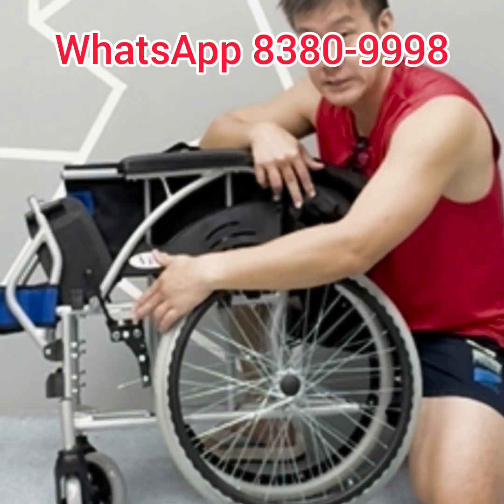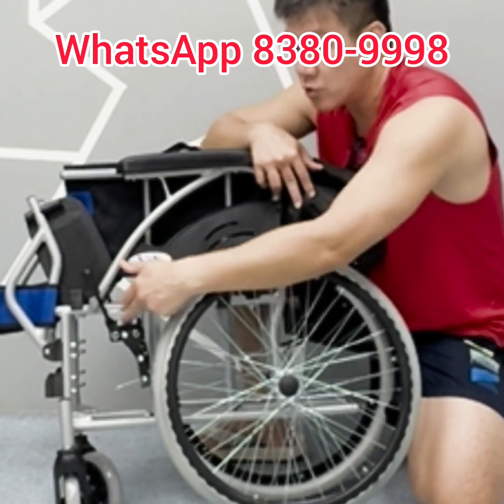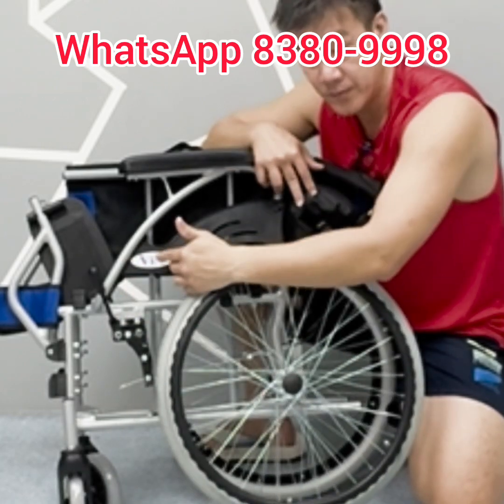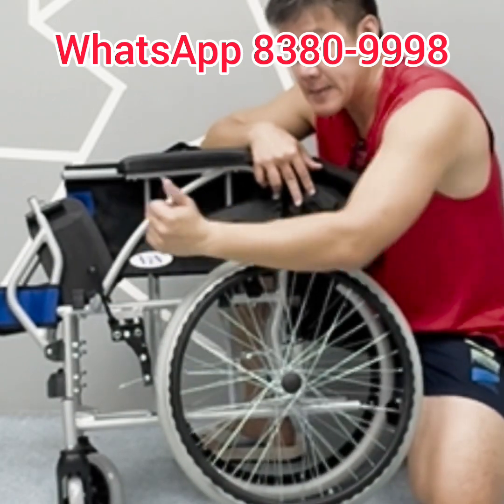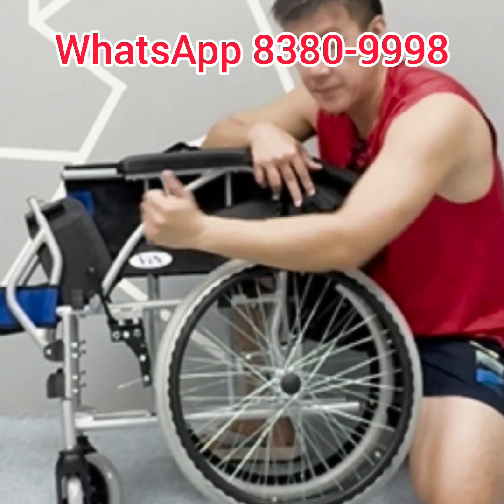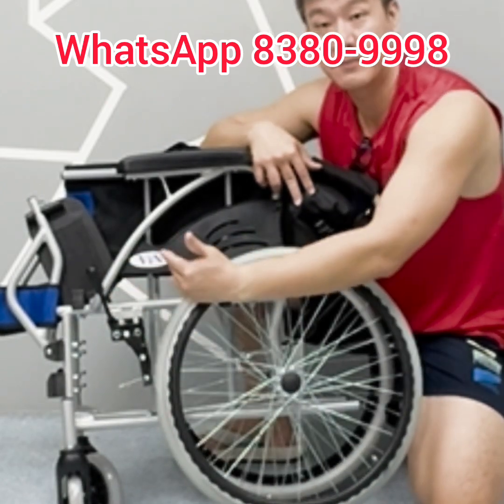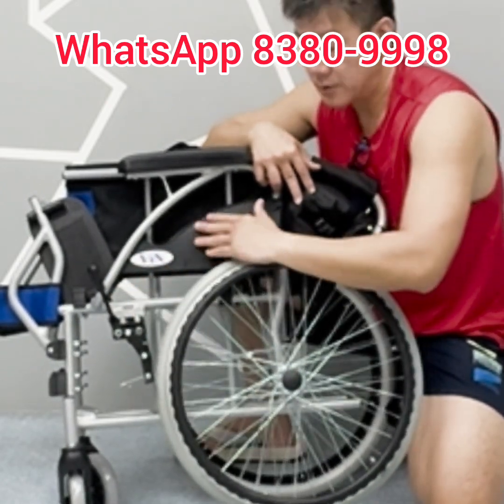Two-bolt-through fixing is used for the braking system. Why? Because with only a one-bolt-through screw, every time the assistant applies the brake over a period of time, the brake shifts its position and you constantly have to do brake maintenance, which is very troublesome.